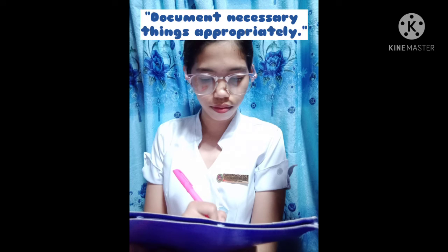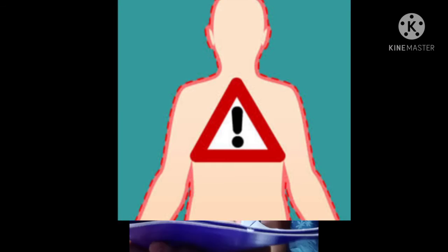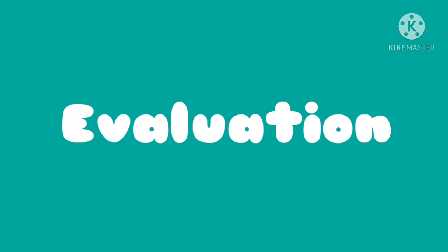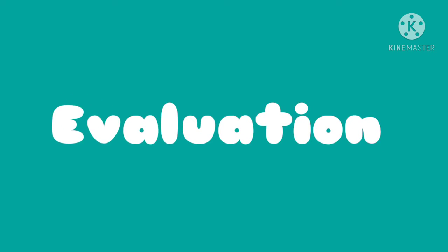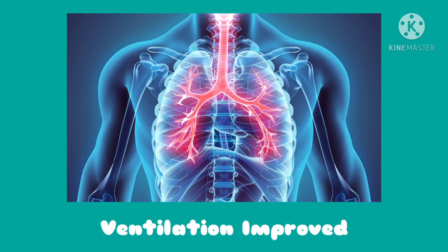Document necessary things appropriately, such as nursing practice, adverse effects, and abnormal findings that should be reported immediately. After administration of medication, evaluation is necessary. Look for increased expectoration, less labored breathing, improved lung sounds, and improved ventilation.